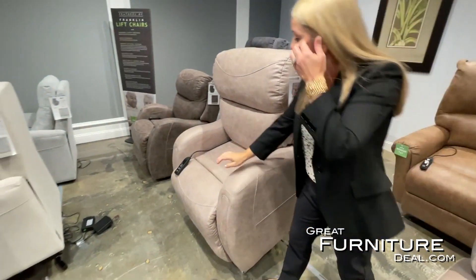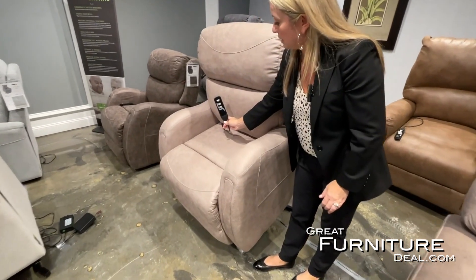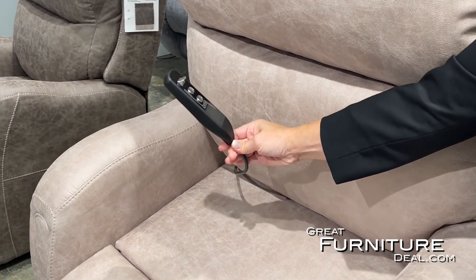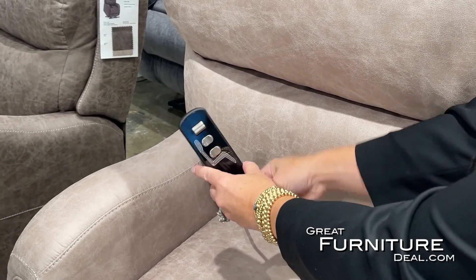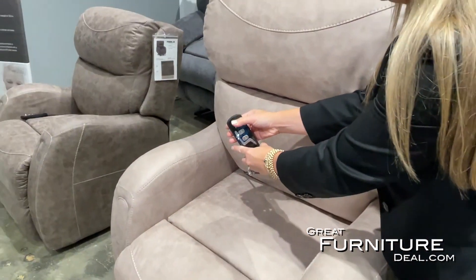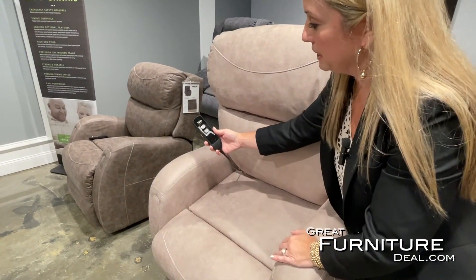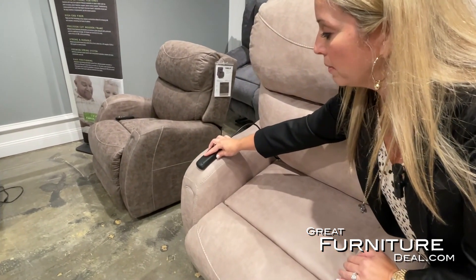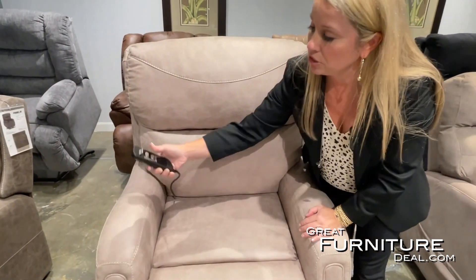This particular remote is quite simple to use — this is an example of one of our lift chair handheld remotes. From the side angle, this button sticks out and is easy to operate. You can simply flip the switch to bring the chair down or push the chair up. If someone has arthritis, they can just push it on the arm forward or backward — it's easy to operate.